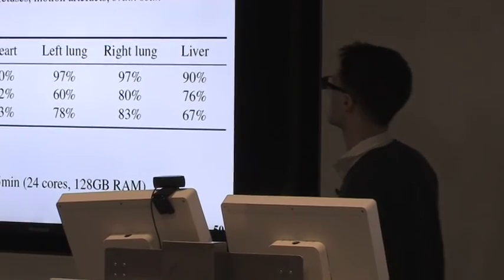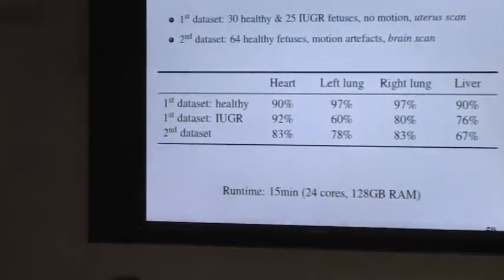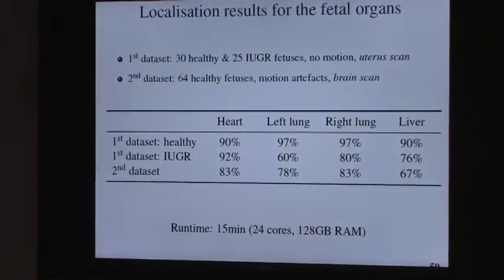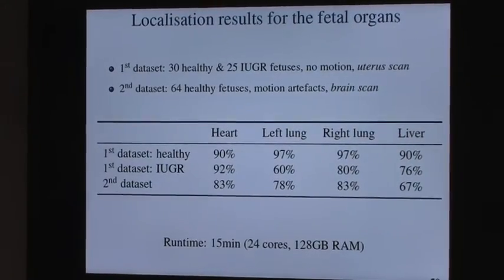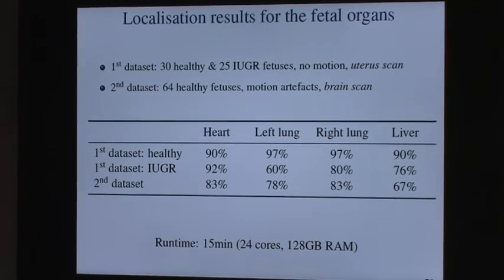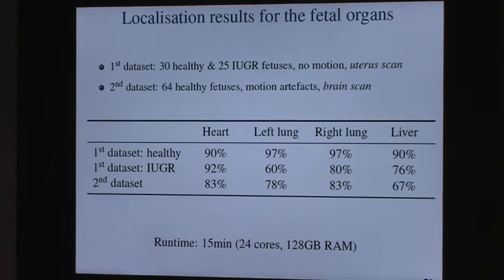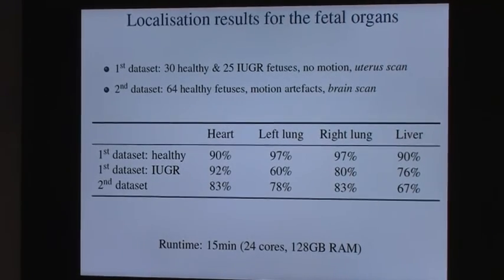In terms of evaluation, I evaluated it on 2 data sets, but mainly the first one was more for training. It was the one I used for training, and the validation was done using leave one out. The second data set is much more challenging, and it actually corresponds to the one I'm interested in, the one we use for motion correction.